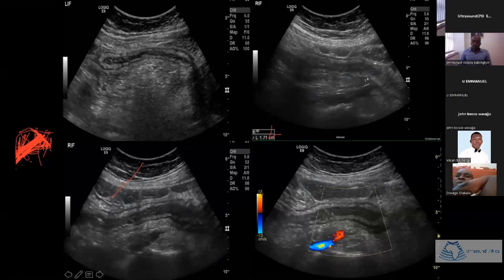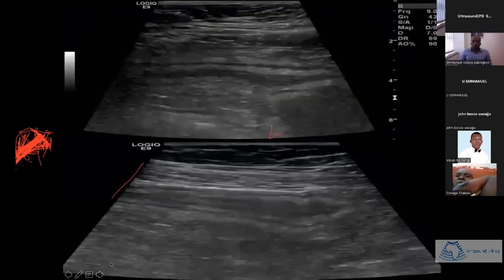With a scale of 12 on the color Doppler scale, we couldn't get any vascularity there. However, if we had used contrast ultrasound or some fancy feature on newer equipment, like microvascular imaging, we might have been able to get it possibly. When we switched to a linear transducer using 9 megahertz, we couldn't really get much information that we didn't already know.